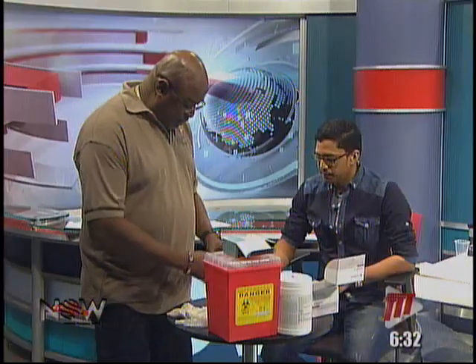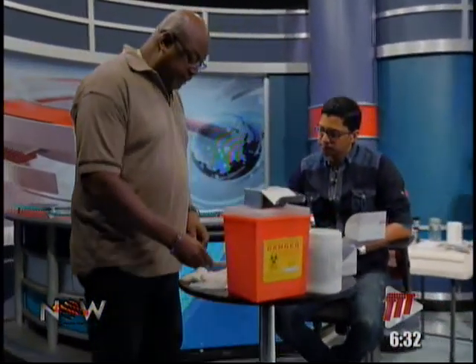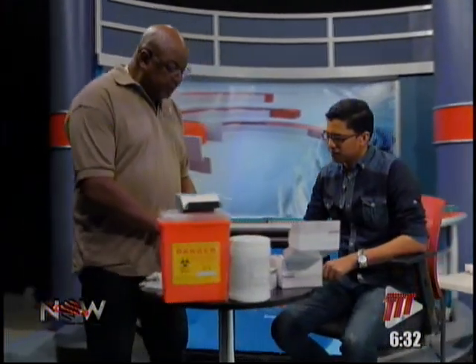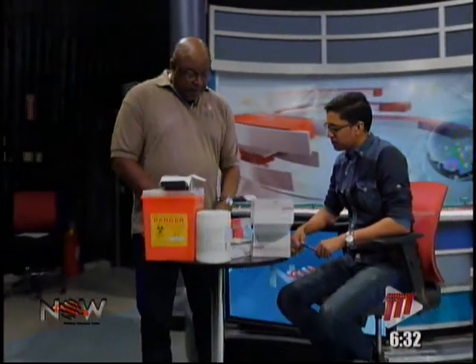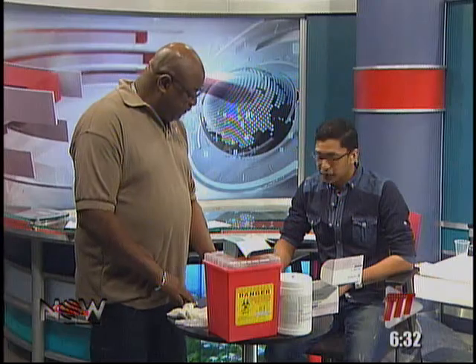It's an algorithm of 3 tests: the Determine, the Unigold, and the Stat-Pak. In the first instance, we use the Determine and the Unigold. If there's a discordant reading, meaning 2 different readings, we go to the Stat-Pak, which is a confirmatory test. Whichever one the Stat-Pak result matches with will determine positive or negative. Okay, so we're going to do this test.